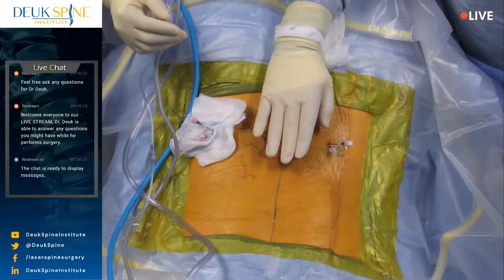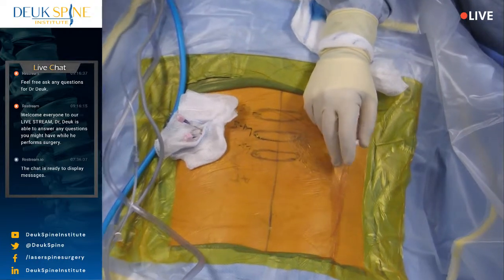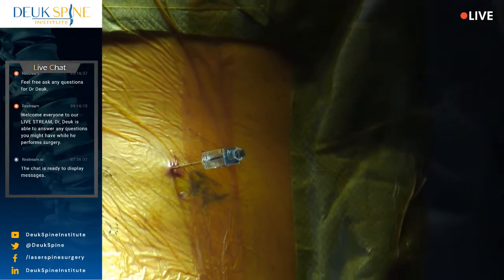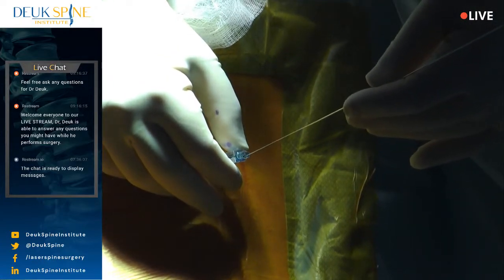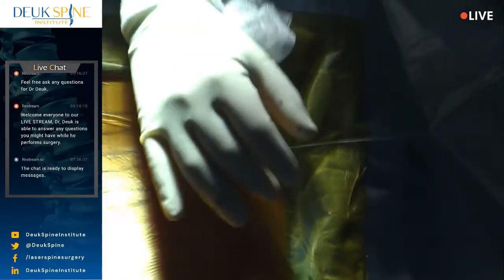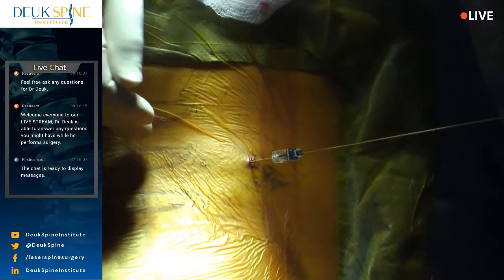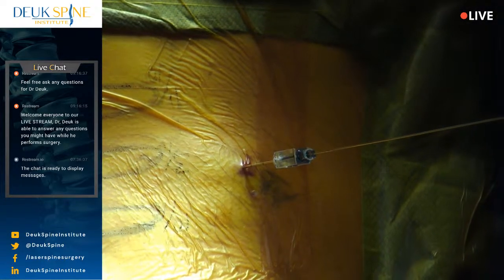Most disc herniations that are painful happen in the lower back. And we just tested these 3 discs. All 3 of them cause the typical pain that this patient experiences. So I think this patient's going to be very pleased with the results of the surgery. We decided to do L3-4 on the patient's left side because she actually has left leg pain as well as right leg pain. So if I did all the discs on the right and didn't do the left, I wouldn't be able to treat the left leg pain that she's having.